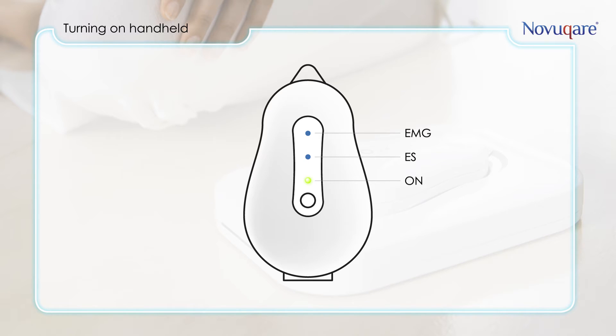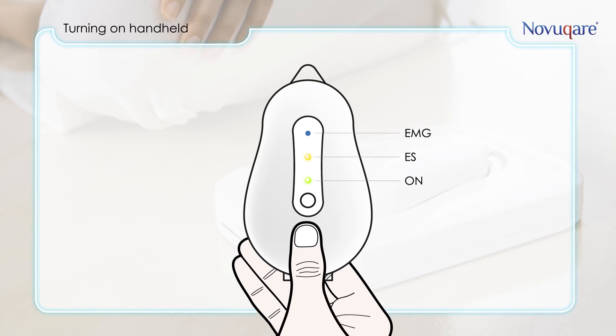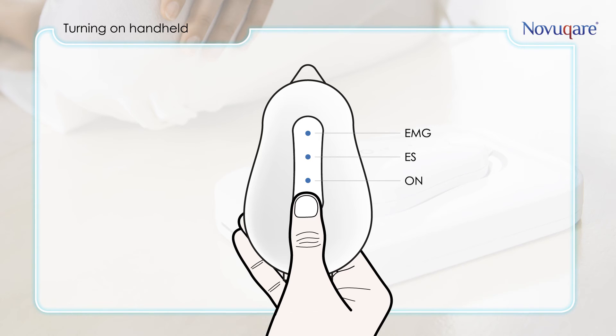When the ON LED is blinking, the battery is starting to get low and charging is recommended. When the EMG LED is on, an EMG measurement is in progress. When the ES LED is on, an electrostimulation session is in progress. Turning off the handheld can be done by pressing the on/off button shortly.